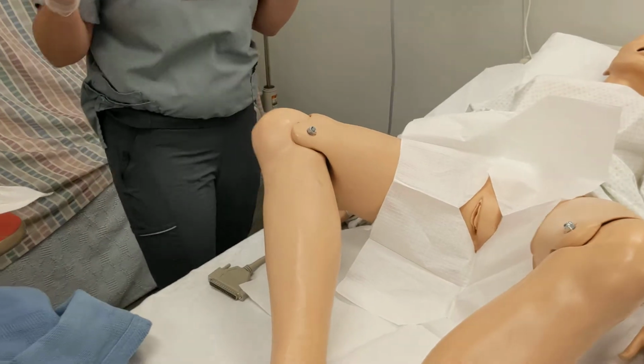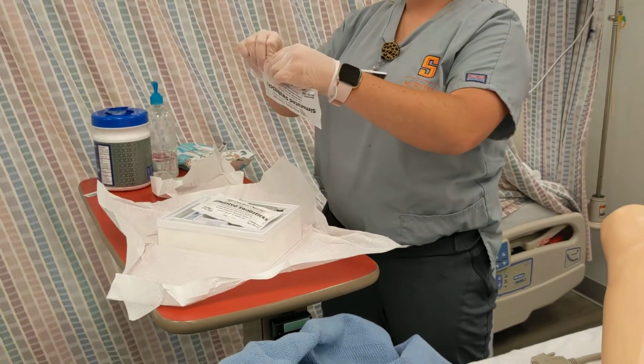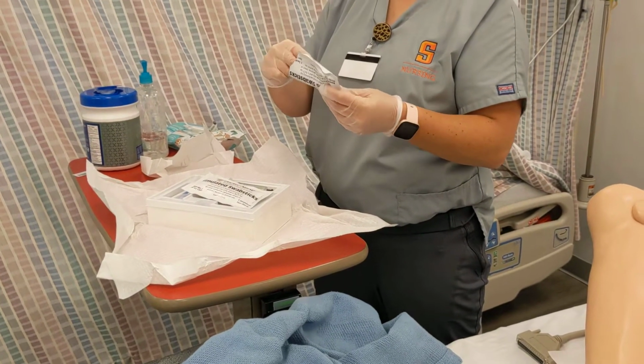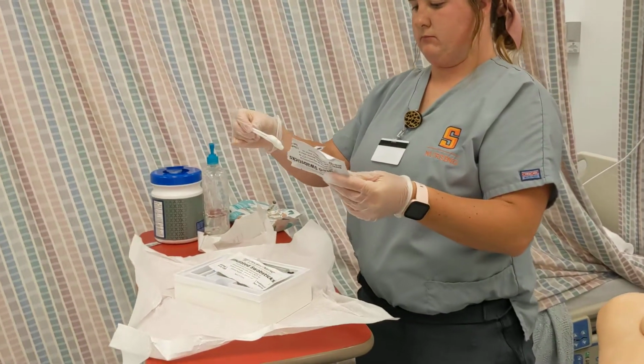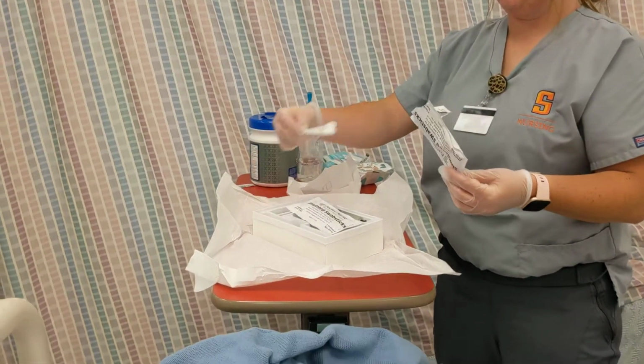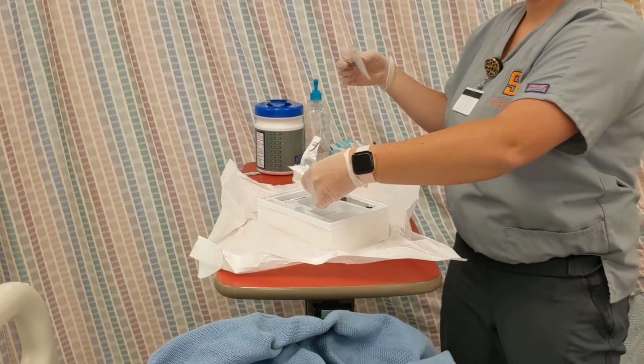Okay, great. Now we're gonna open up all our supplies. So I'm just gonna leave it in the package and we're just gonna keep it right here.